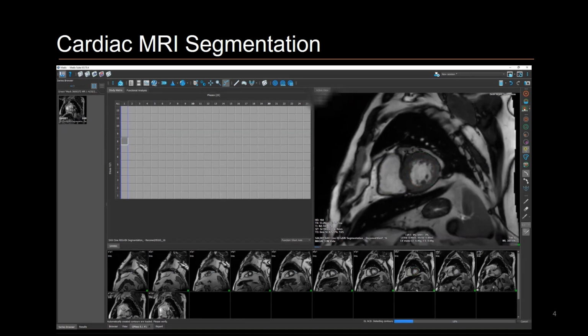Machine learning models have been proposed for automated contouring. However, these models typically lack flexibility for manual adjustments and quality control. And while commercial CMR segmentation software has increased accessibility, they are often slower to update algorithms, which has limited flexibility for research, falling short of meeting the evolving demands for CMR imaging.